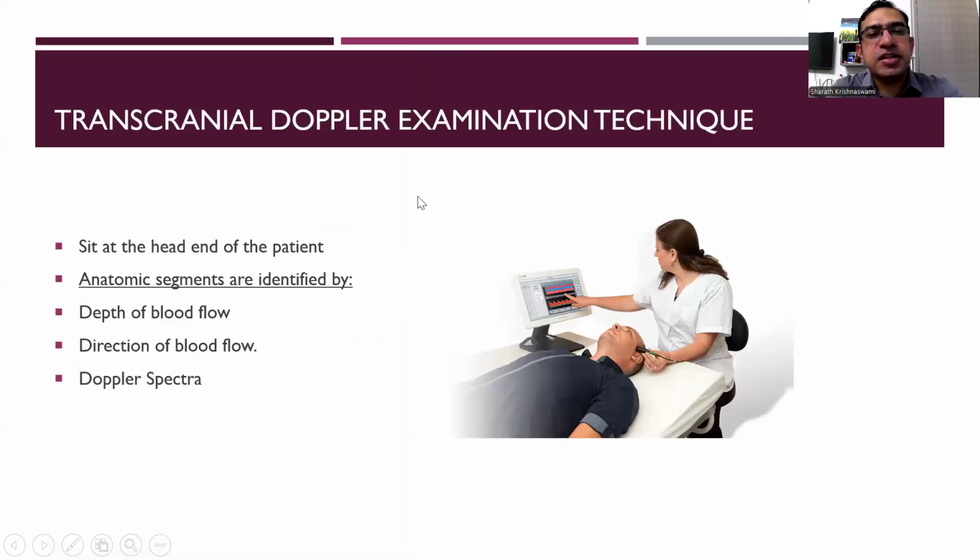So how will we do the transcranial Doppler examination technique? You will have to make sure you're seated in a comfortable position at the head of the patient. Make sure the patient is comfortable and lying supine with his eyes facing the ceiling.